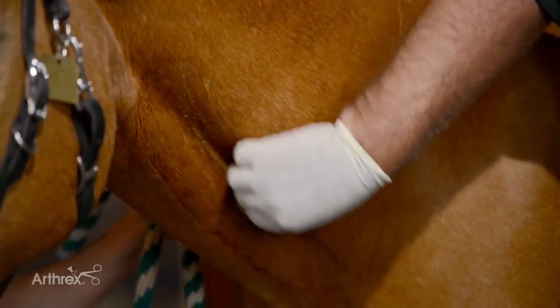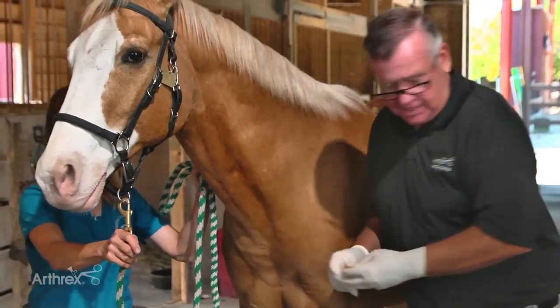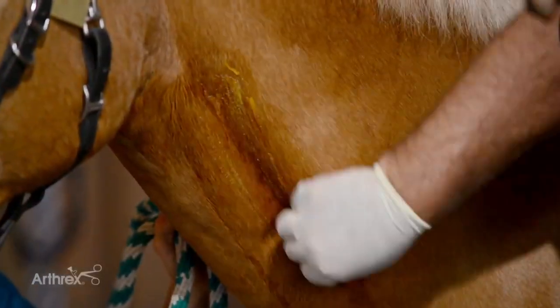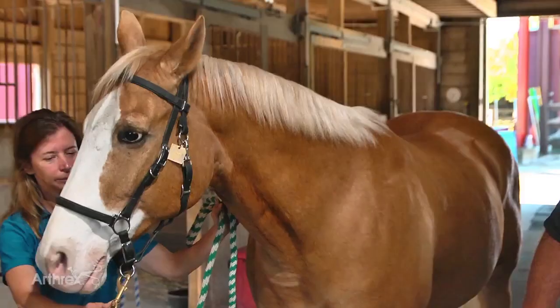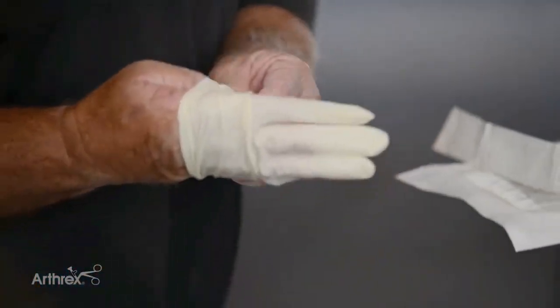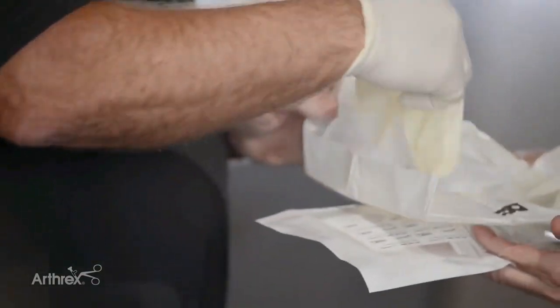In preparation for the ACP, we like to clean the jugular area as good as we can. We do it at least 3 times with betadine and alcohol. Because it is a blood product, we want to be as clean as possible at all times. And that means at all places of harvest and preparation. After preparing the jugular, I go ahead and put sterile gloves on for harvesting the blood.